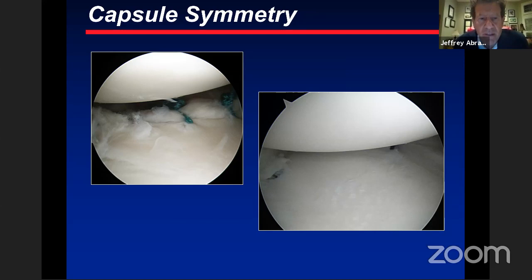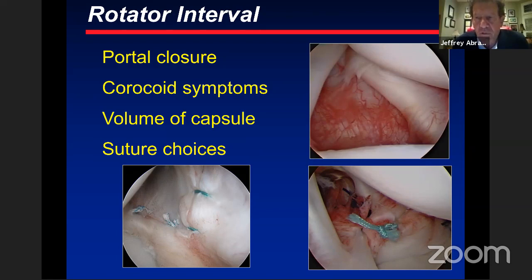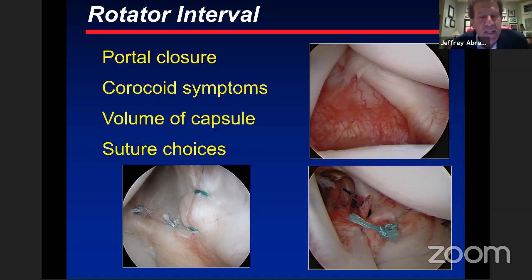After placing sutures, the capsule may look like this with the humeral head now centered. We're not done yet — we also want to make the capsule a bit thicker using side-to-side sutures in the lower left, as seen in the corner. The pictures on the right show a rotator interval closure, which has come under some controversy. In a true multidirectional case, this is not the same as a loose shoulder in an overhead throwing athlete.